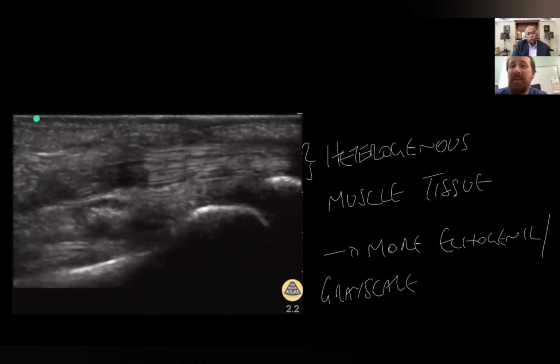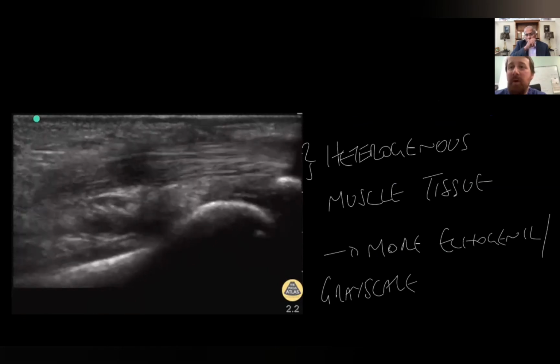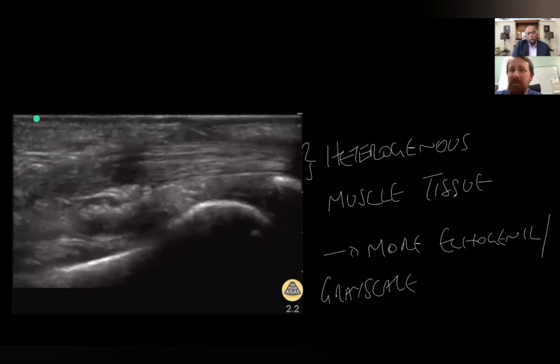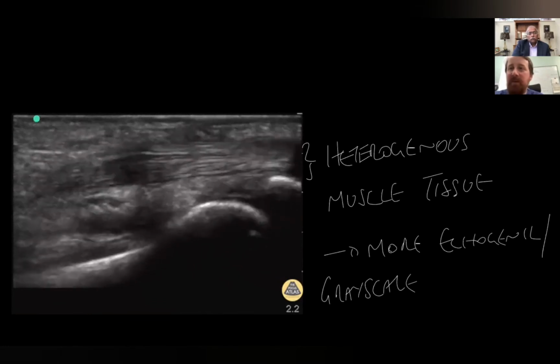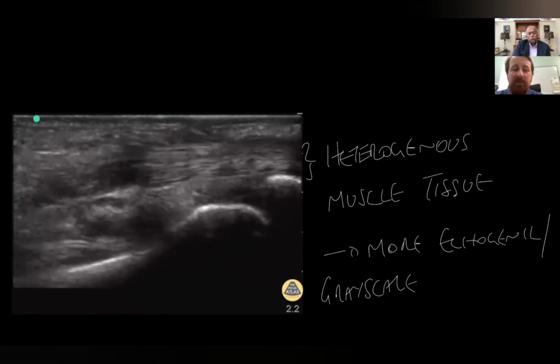And you can see that there's actually quite a huge amount of detail that we're seeing in each of the muscle fibers being picked up there in really, really beautiful, nice detail. Okay. But that's because they're all subtly different to the surrounding densities there. Each of the muscle fibers is being highlighted on its own because it's not the same density as the one that's adjacent to it.